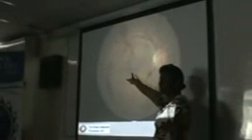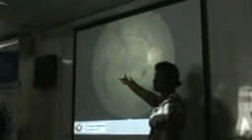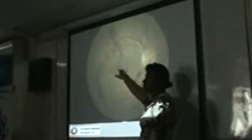And if you remember back from the slides this morning, there are so many abnormal blood vessels at the disc. Yeah? And we can already see pre-retinal hemorrhages. That's a sign that one of those abnormal blood vessels has broken already, and it's bled. Her vision is still good because her macula looks okay at the moment. And the bleeding hasn't covered the macula, and there are no exudates that have caused swelling. That's why her vision was still 6/9.